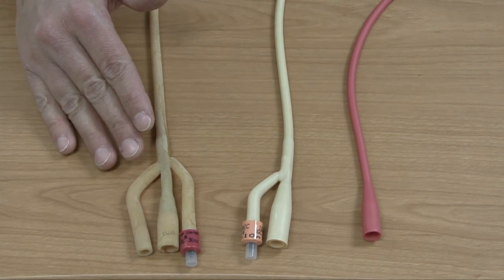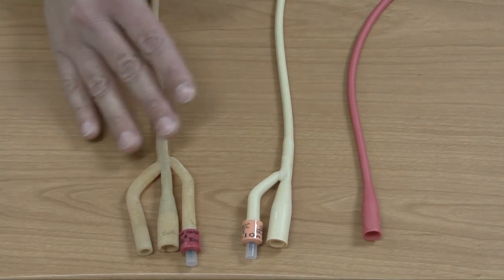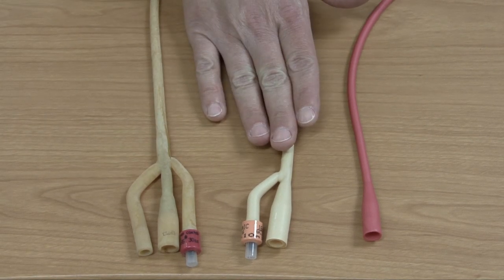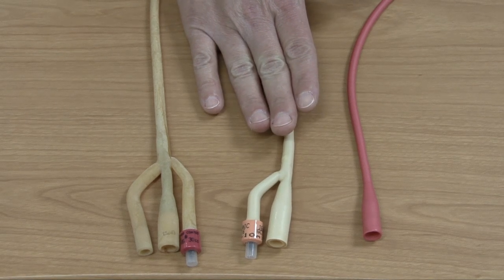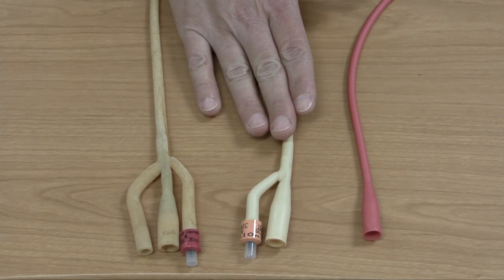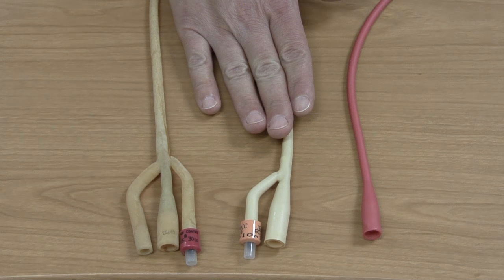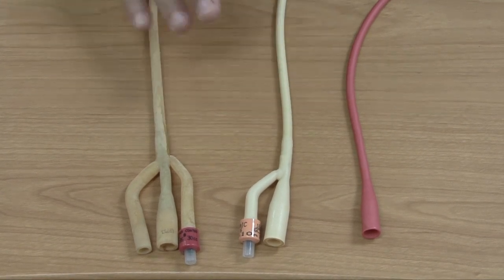The reason you need to consider catheter size is because your patient's urethra varies in size based on their anatomy and also their age — an infant or pediatric patient is going to have a smaller urethra than an adult. Sometimes different patients will need smaller catheters. Even though you might have an adult female, you might have to go down from a 16 French to a 14. If you meet resistance, you might have to start over and come back with a smaller catheter.